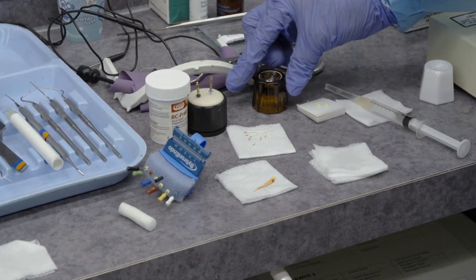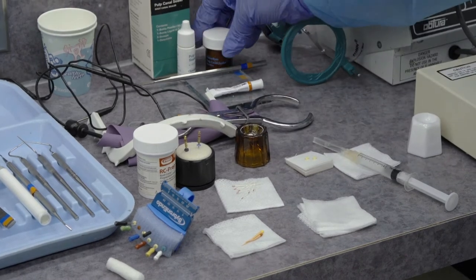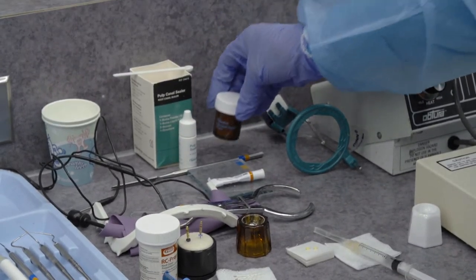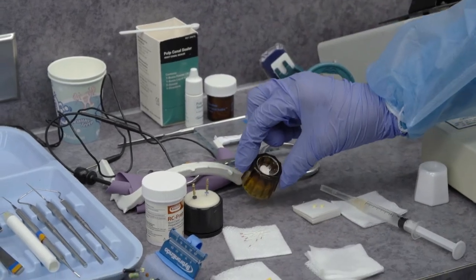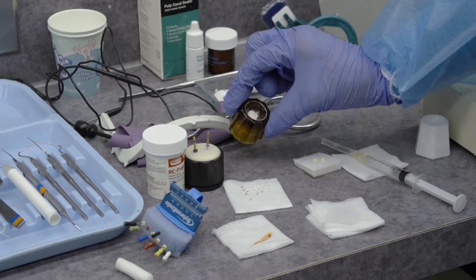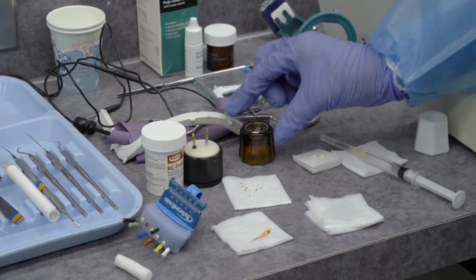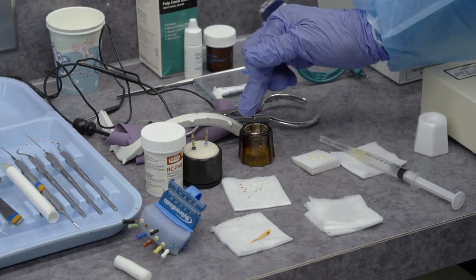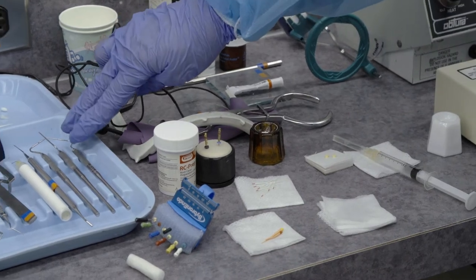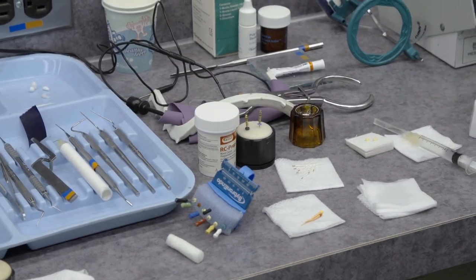I have here a Dappen dish with some powder, which is actually from the Cybron Endo sealer. This is to be utilized, and I'll show you what that looks like during the procedure. When you are practicing, you're not going to have the powder in there, but I'm just showing you, in a dental office you sometimes utilize the powder in the Dappen dish to dip your pluggers onto, and I'll show you what that looks like during the procedure.